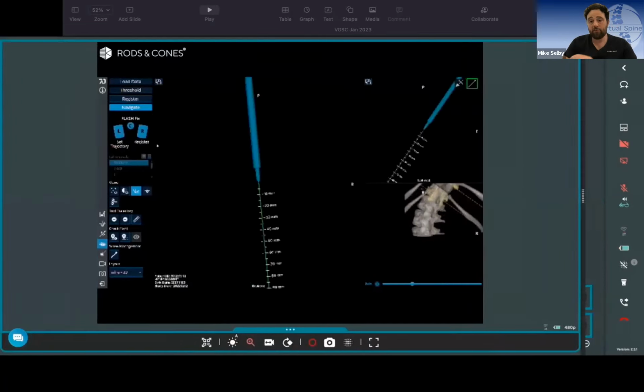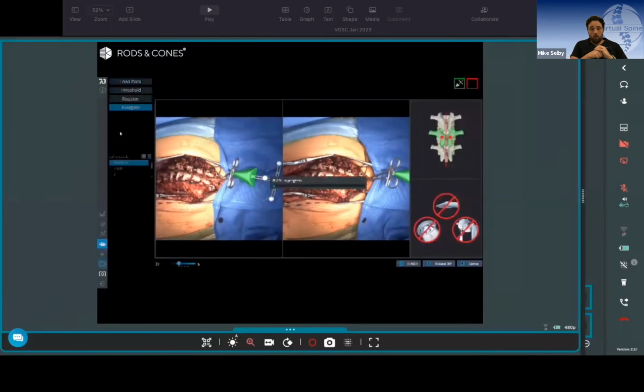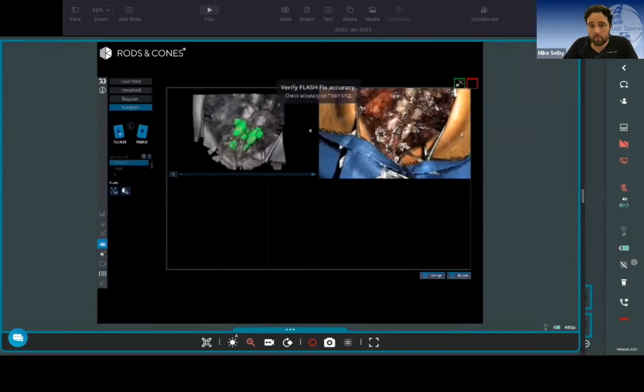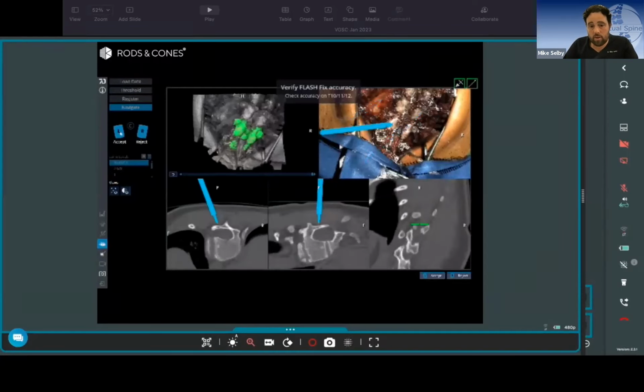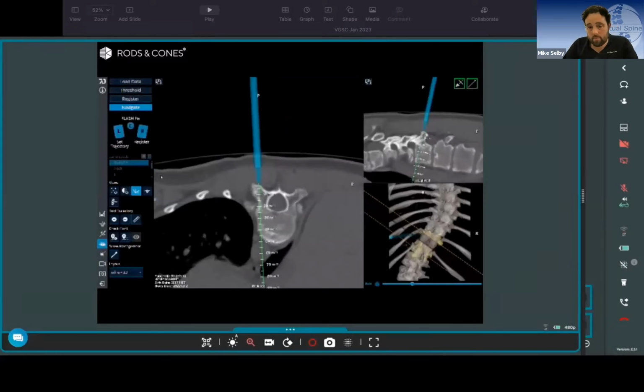So, video of Flash Fix. Ali, this is the Flash Fix we were talking about. We've gone back to our registration screen, and we've just reflashed via the operating theatre light where it's housed. I just felt the probe was floating a bit. I wasn't happy with the registration, and that may be because we've pushed on the spine or something else has moved. And then it comes back to this green screen. Better? Much better. Because we put it through, it just started to drift a bit.